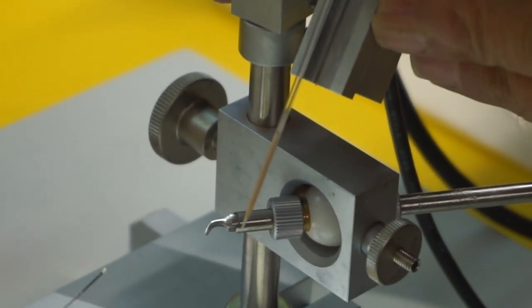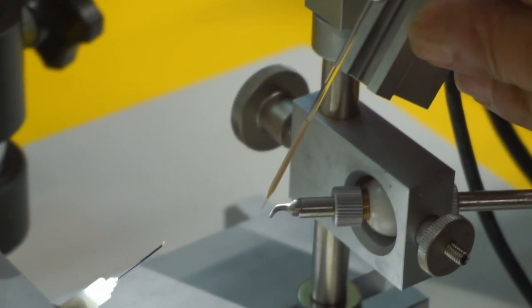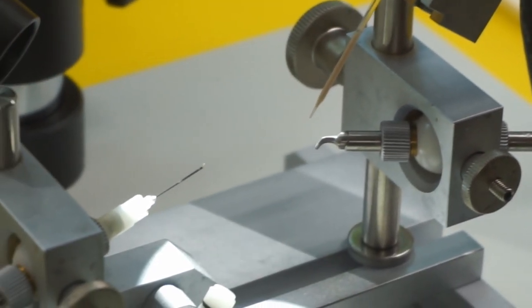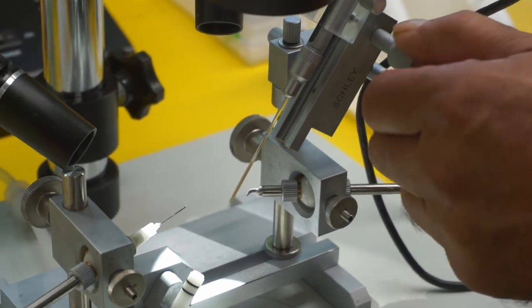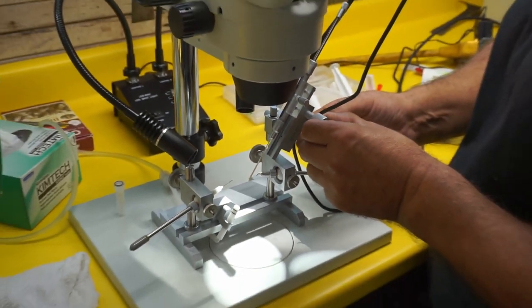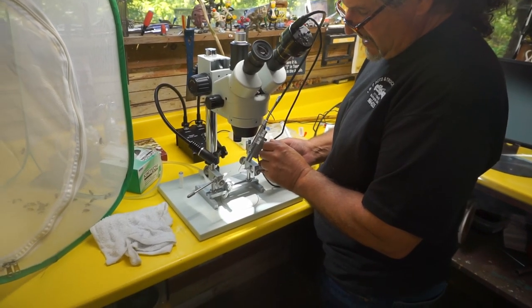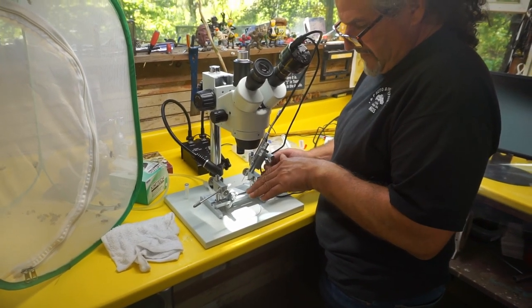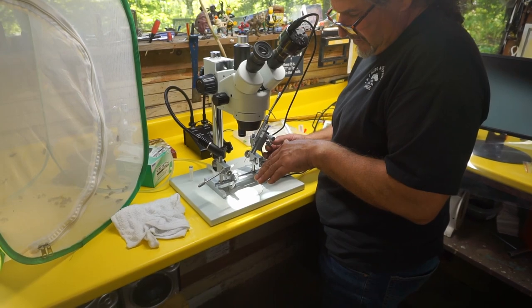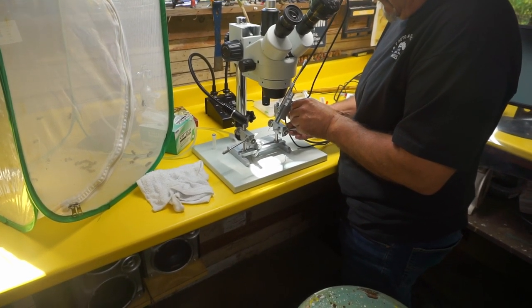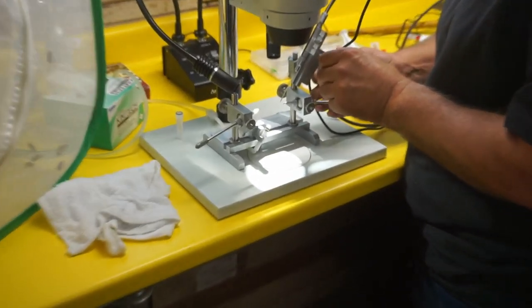Okay, so the idea here is to line up your tube with the center of that. Our queen is going to be going in there. All right, there's two actions here that need to take place when we get into the queen. You're going to be inserting in, and then at the same time once you hit that valve, there's a valve that you have to bypass. You lift it up a tiny bit and insert it at the same time. The valve fold you're talking about? Yeah, the valve fold. So we're going to back this out.